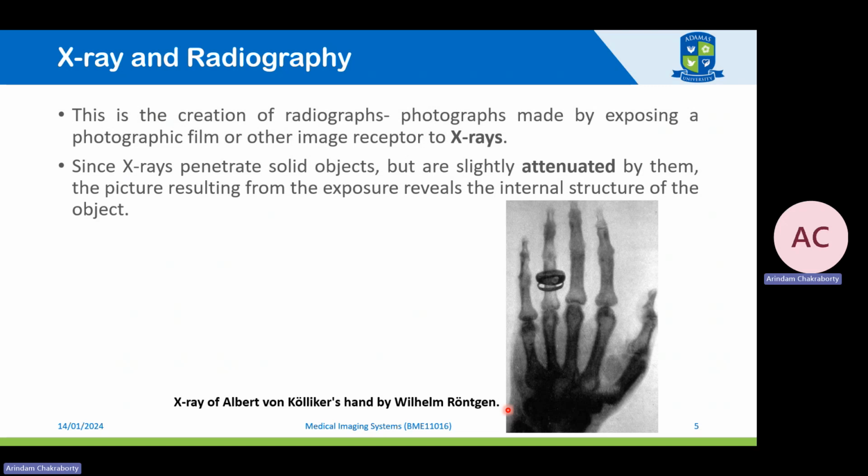The picture is produced by the attenuation or absorption of the X-rays by the different organs, soft tissues and bones inside the body, and that is known as radiography.